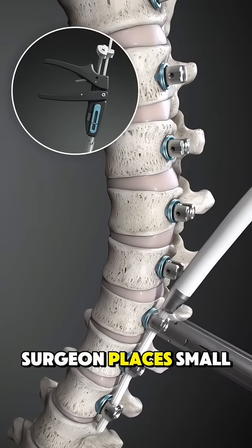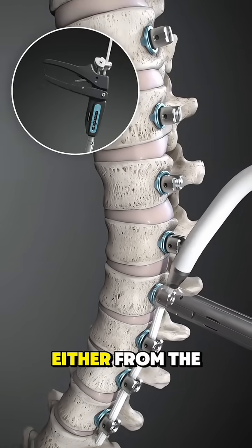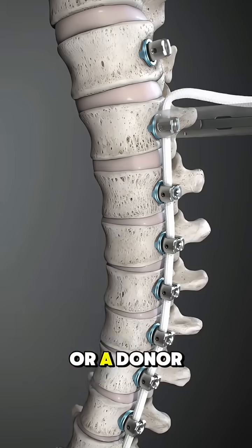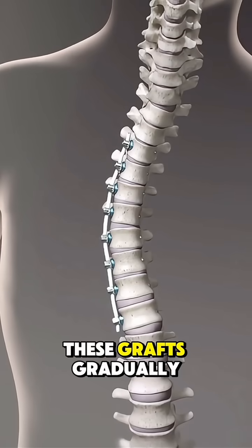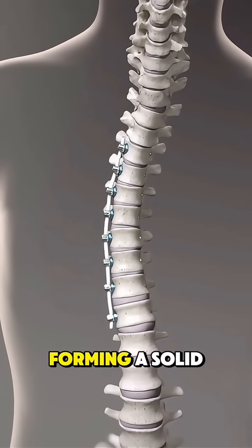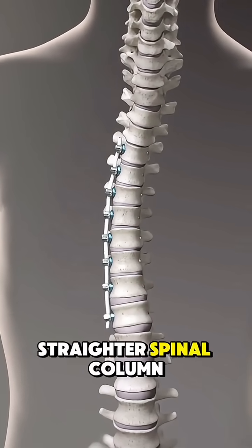Once aligned, the surgeon places small bone grafts — either from the patient's own body or a donor — between the affected vertebrae. These grafts gradually grow and fuse the bones together, forming a solid, straighter spinal column.